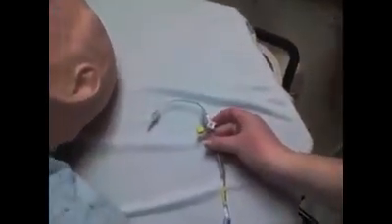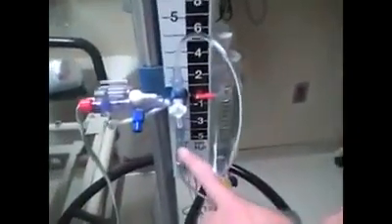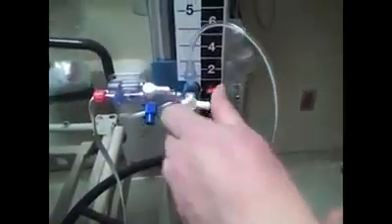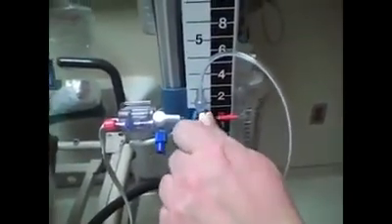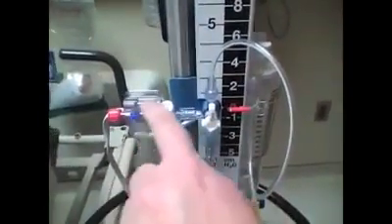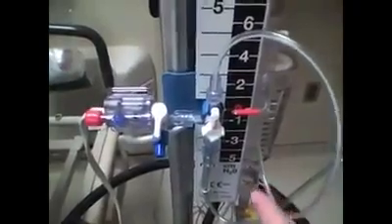Once your setup is zeroed, the doctor will take the catheter and attach it to the ventricular catheter in the patient's head. When you're ready to measure or drain, turn your stopcock off here to allow flow from the patient up into the setup. Right now this stopcock is off, so any flow stops here. If you want to drain into your buretrol, turn it so flow goes that way. If you want to measure pressure, turn your stopcock off to any drainage going into the buretrol, and turn your transducer to on so you have flow to your transducer and it can measure. This is set up to monitor — it's off to your buretrol and on to your transducer.